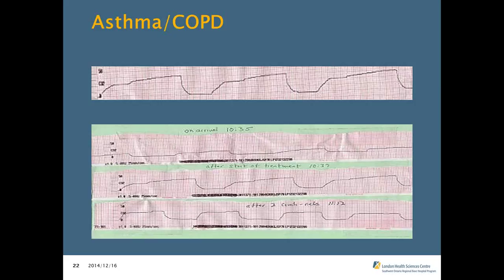They're saying they're feeling better. You listen to their chest. They're less tight, less wheezy. You look at your capnography, and oh yeah, when we first got there, it was these prolonged expiratory waveforms. Now they're shortened up. Less expiratory phase based on your clinical judgment, and you lose that shark fin pattern because of the decrease in bronchospasm from your treatment.